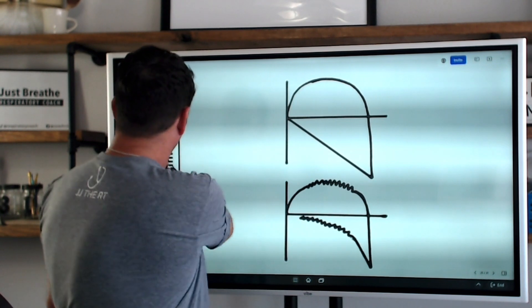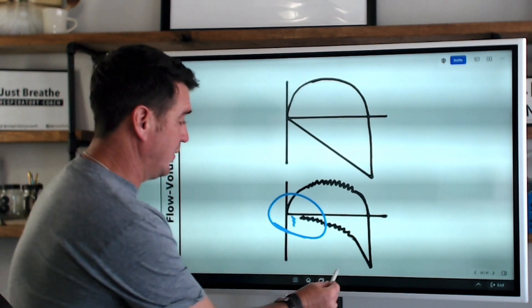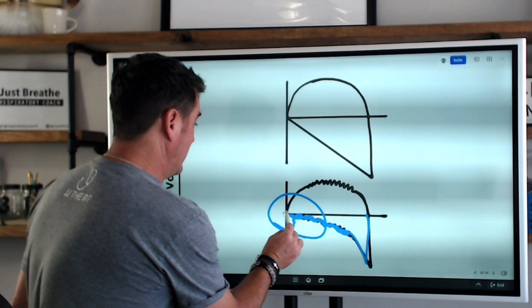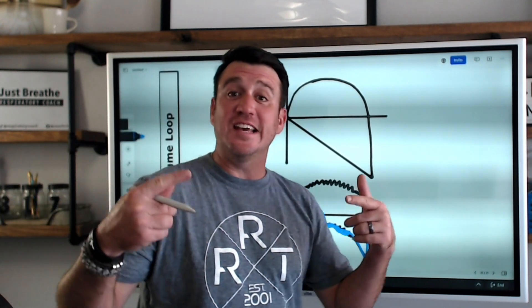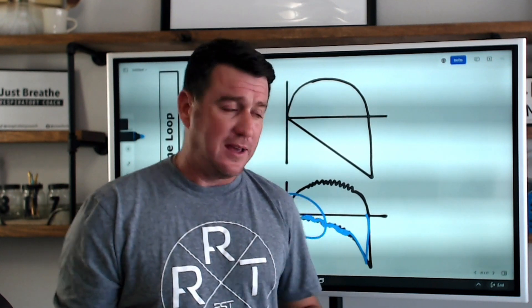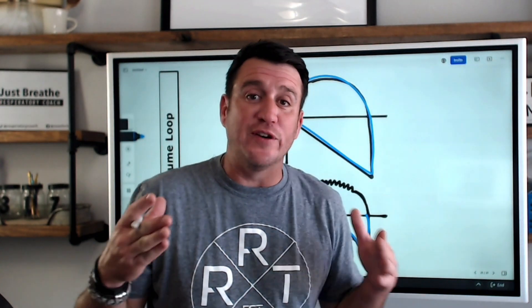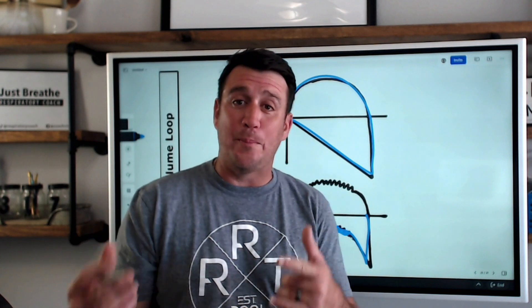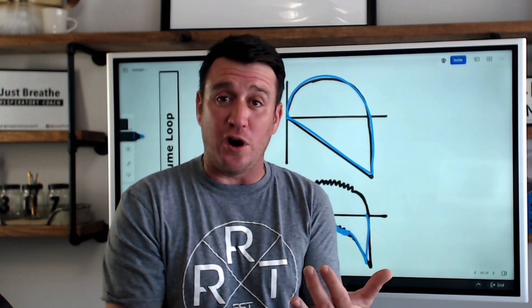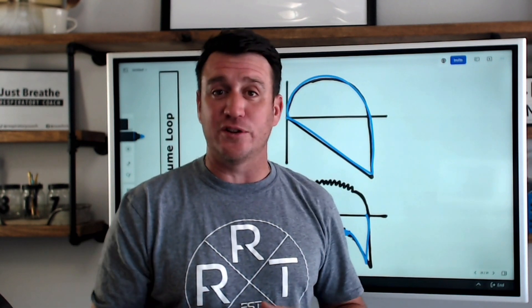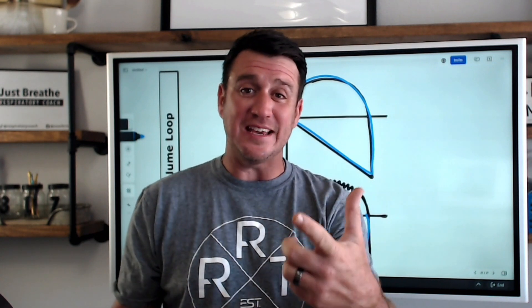One last thing — look at how this loop does not close. The sawtooth pattern comes here and then it stops; it does not come all the way back. When the loop doesn't close, you have to go back to your scalar graphics to see whether it's the volume or the flow waveform that's not reaching back to baseline — perhaps it's both. Maybe there's air trapping, maybe there's a leak. Follow that algorithm to figure out which of the two it might be.